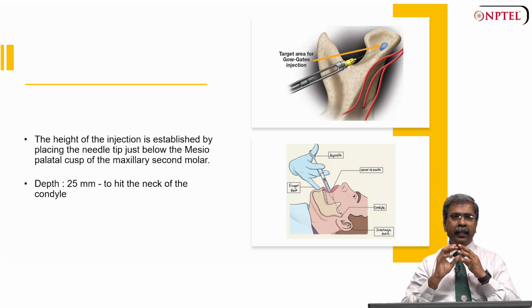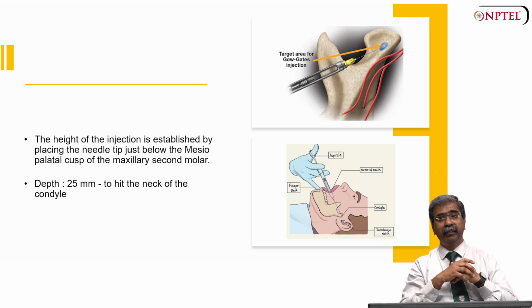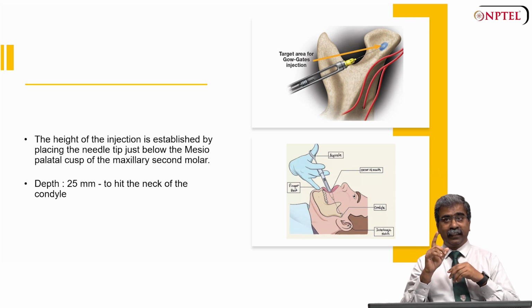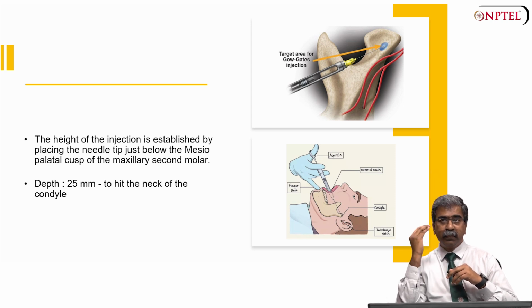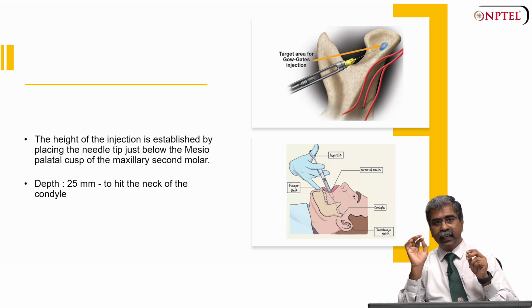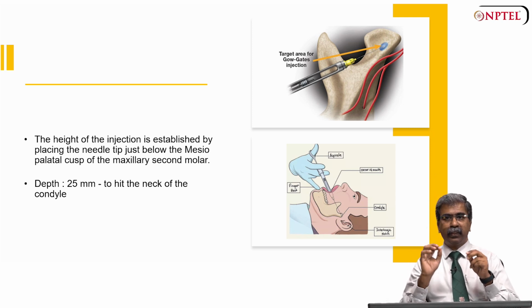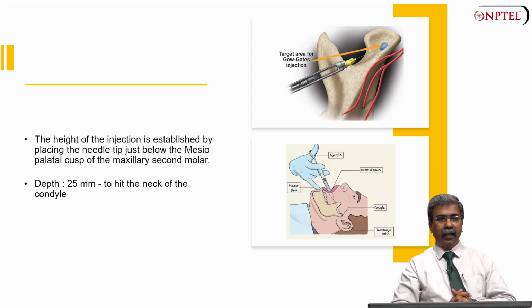And the needle tip is positioned below the mesiopalatal cusp of the maxillary second molar to establish the correct height of the injection. Note this point very carefully. And the depth is approximately 25 millimeters, it should hit the neck of the condyle, ensuring that the anesthetic solution is deposited at the proper target area near the lateral side of the condylar neck.